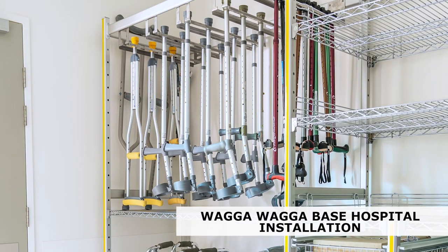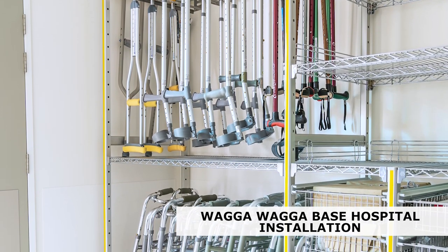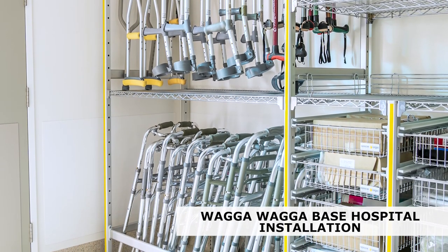In this example you can see a SteriRack orthopaedic storage system configured to store walking sticks, elbow crutches, auxiliary crutches, small parts, walking frames and cam boots.